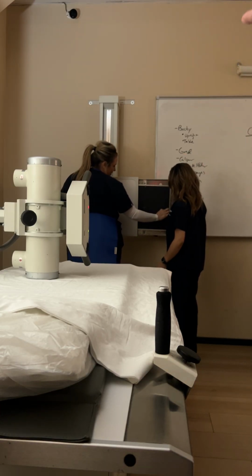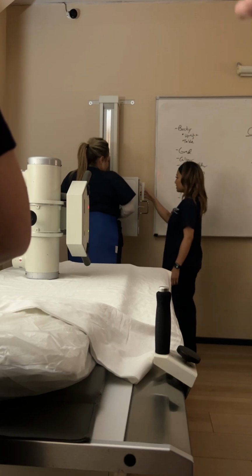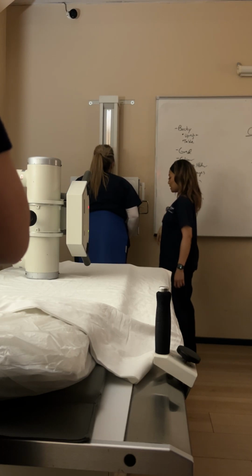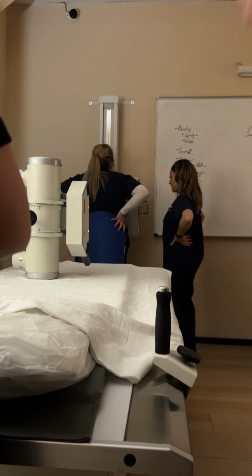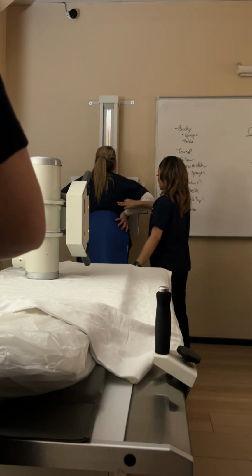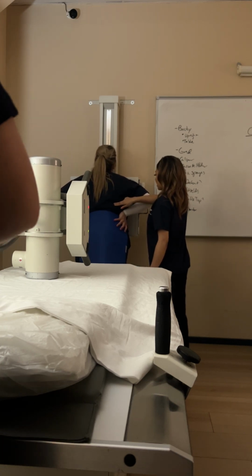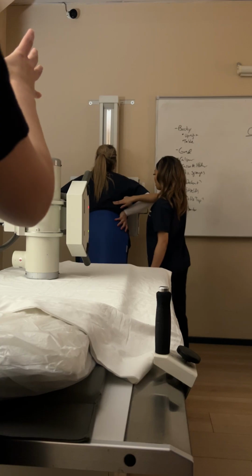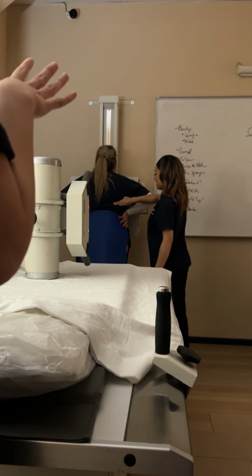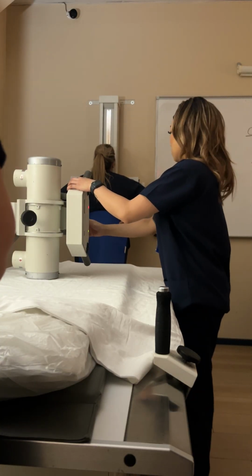Ideally, everything would be pre-set up, so when they first come in, you would do the shielding first. Everything is already set up, after all the introduction and everything. Shielding first. Yes. And then what would be your checklist after that? Everything should be checked off, like SID. Typically what I do is I set up my room. I go get my patient. I bring them into my room. I say, my name is Nora. I'm going to be the x-ray tech. We're going to be taking 2 images of your chest.